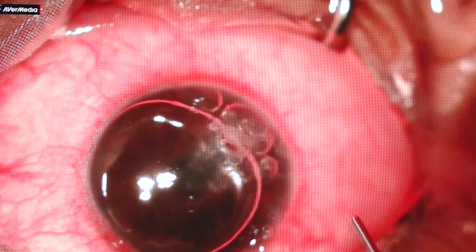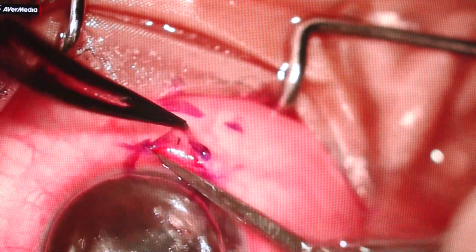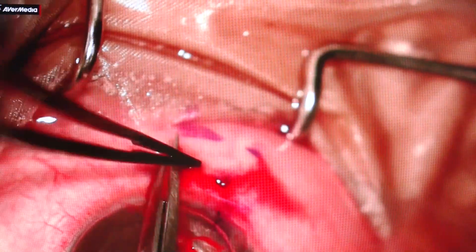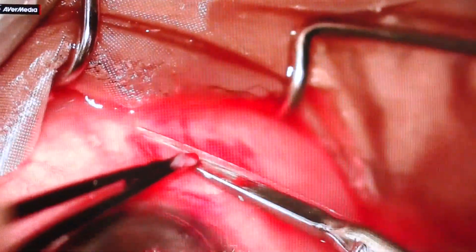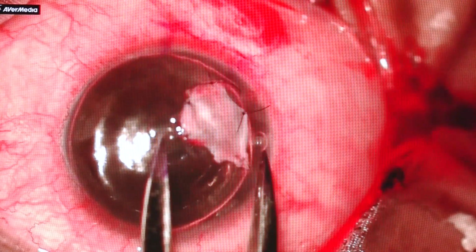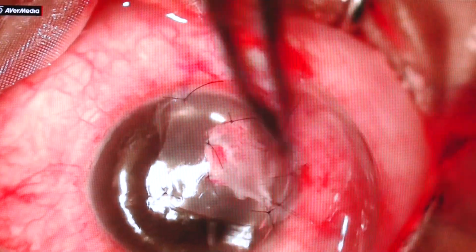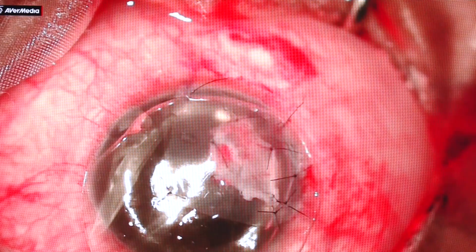Sometimes if we do not have any tissue, obviously Tenon's comes to the rescue. Tenon's is quite elastic, so even a small graft would suffice. So here sutures have to be given because it swells up later on and then it can get dislocated.